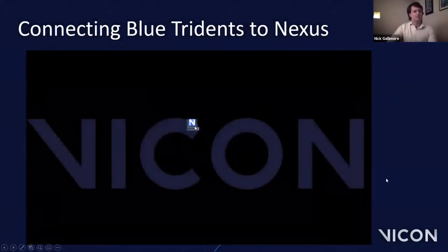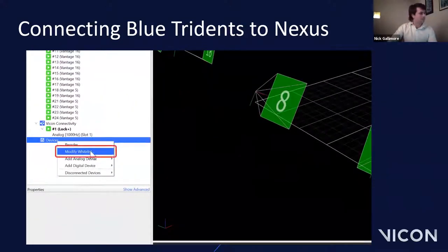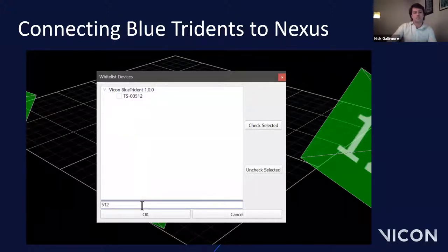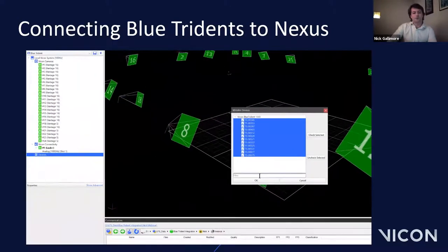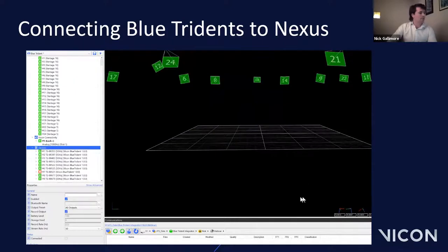So let's go through connecting the sensors. You open up Nexus and allow your cameras to connect as usual. Once everything in the system tree is green, go to your devices node, right-click and select 'Modify Whitelist.' In the dialogue window that pops up, you can see all your Blue Trident sensors listed. Select the sensors you require — it's always a good idea to note the sensor serial numbers. You can search for specific sensors or highlight them all and use the 'Check Selected' button.